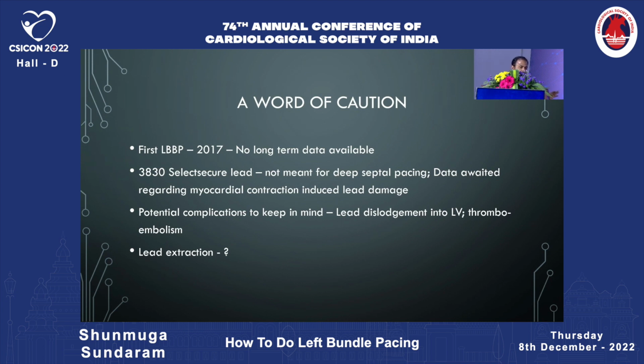The guidelines have clearly pointed out that they are not going to recommend it. This is the 2021 European Society of Cardiology guidelines. But after that, a lot of things have changed. We have 2 randomized trials recently published and at least a dozen trials undergoing, recruiting patients for comparing RV pacing versus left bundle pacing, and biventricular pacing versus left bundle pacing. So all these results will probably be favorable. That's what we are hoping.